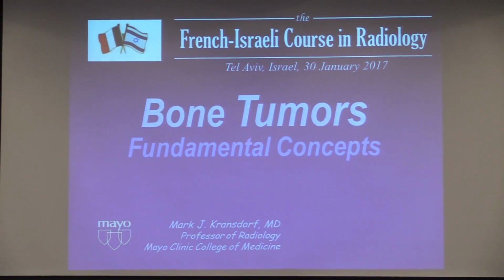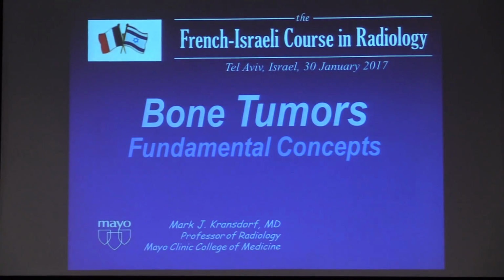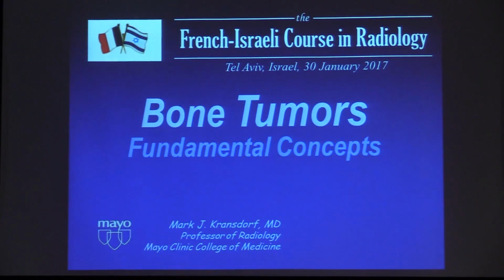What I'd like to do is talk about some fundamental concepts in the analysis of osseous lesions. I recently was involved in a project evaluating radiographic assessment of osseous lesions and assigning a value for their biological activity, something that's been done many times, but not recently. I'd like to share some of the insights I learned on that project, in the sense that we had to review the literature, and it really was a very interesting thing.